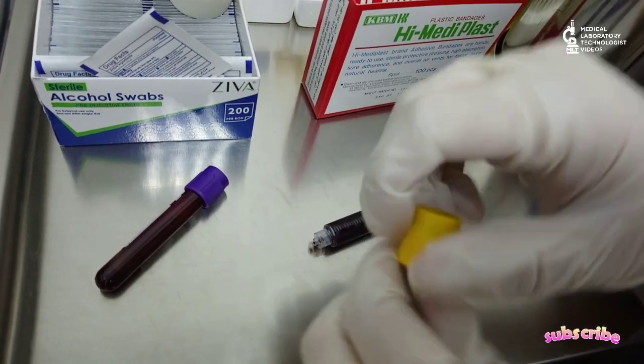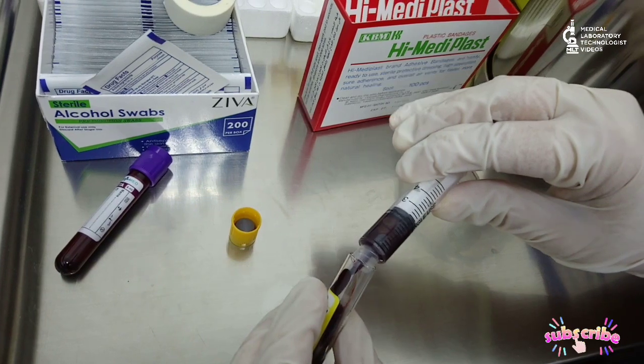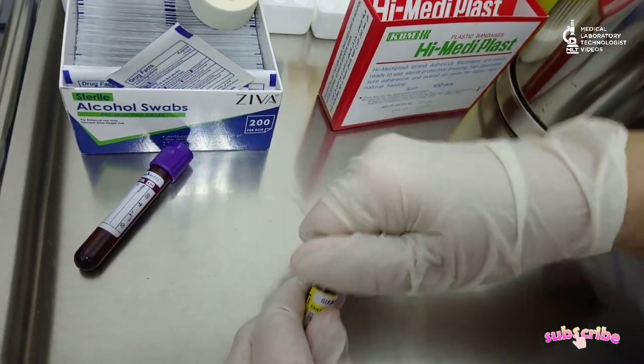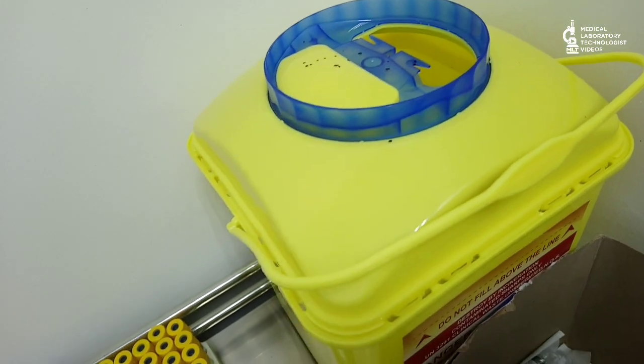Add the sample into your required tubes. If you are using EDTA tubes, after the sample enters you have to mix the tube so that the anticoagulant mixes with the blood. The yellow tube is a gel activator tube, used to collect serum. Discard the needle in the sharp container.